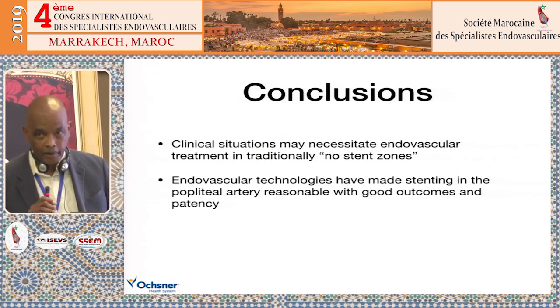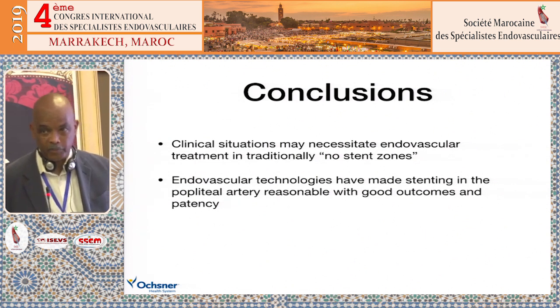For example, I had an 18-year-old patient who was an American football player who had come from another institution after presenting with leg pain and had a Supera stent placed in his popliteal artery. And I think most of you out in the audience will be able to figure this one out before we even got to the final answer. But this was popliteal entrapment, and the patient, once he was referred to me, had an angiogram, but was referred to surgery to have the popliteal entrapment released. So you have to know the history, and you have to take all of that into consideration before you attempt any of these procedures. Just because you can mechanically or mechanistically get a stent or a balloon in a certain place doesn't mean that that's the right thing to do.